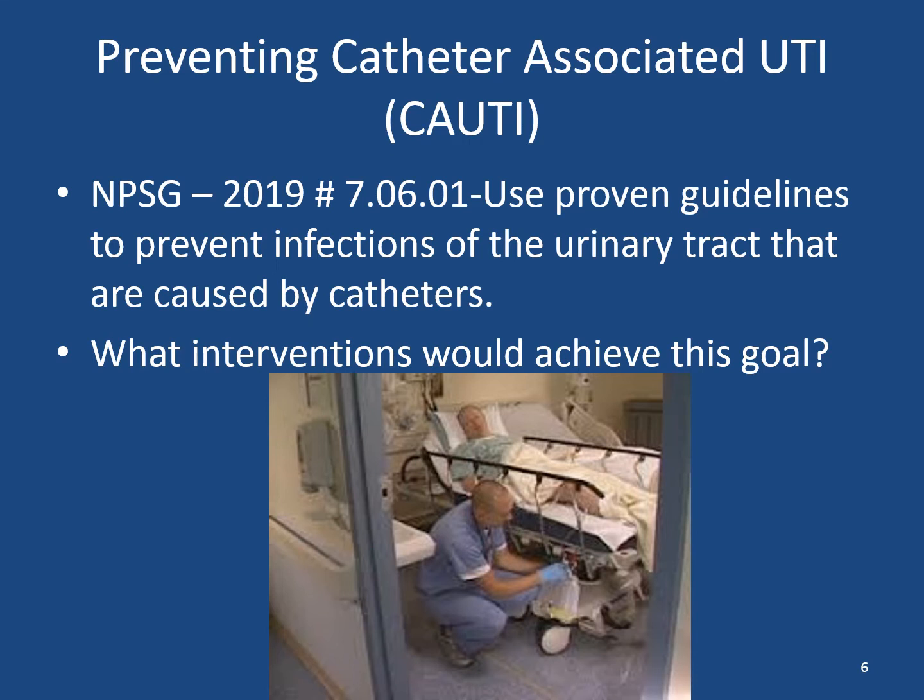We want to keep the catheter or the drainage bag at the level or below the bladder. We don't want that backflow of urine into the bladder. Keep the bag off of the floor. Obviously, the facility floors are dirty. We're walking through different things. We keep it as clean as we can, but we always anticipate the floor is contaminated.